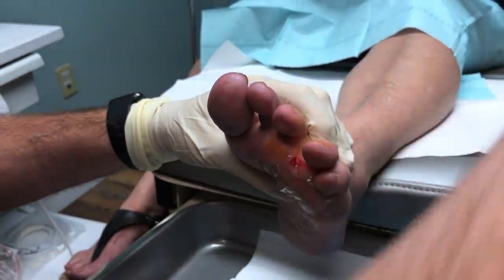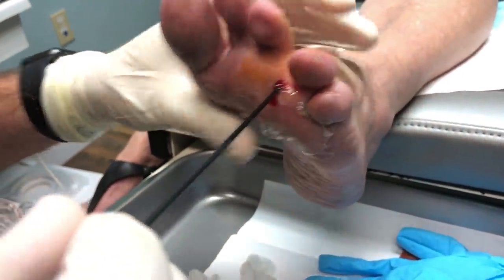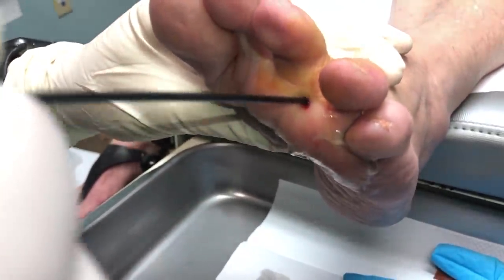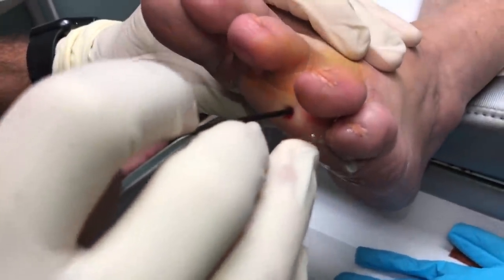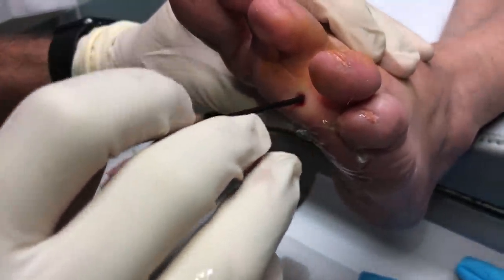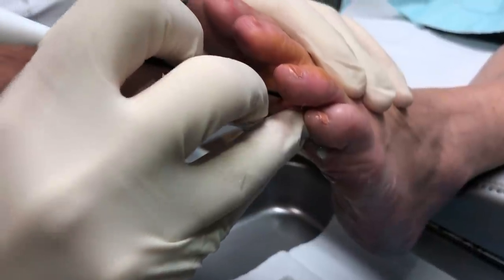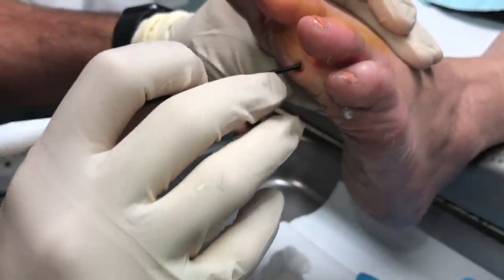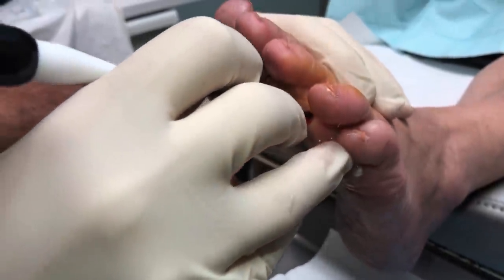This is the probe. Just the tip of it is actually the freezing portion. We're going to clean it off first so you can see, then insert it in here. Now we're going to punch through the tissue. Usually when I pull down, if the toes move, I know I'm underneath the intermetatarsal ligament. We pull down and you can see how the two toes go with it. Generally speaking, before we check the ultrasound, I have a good idea that I'm in the right area.